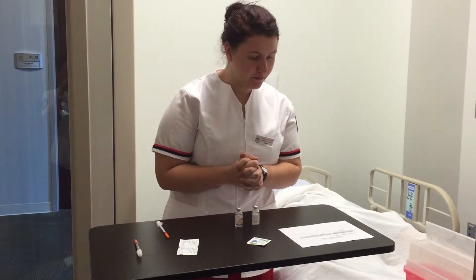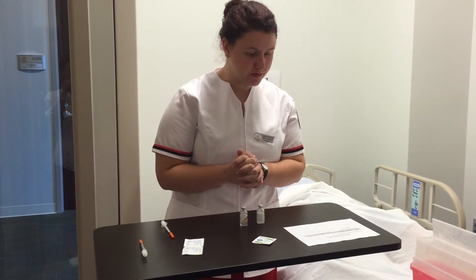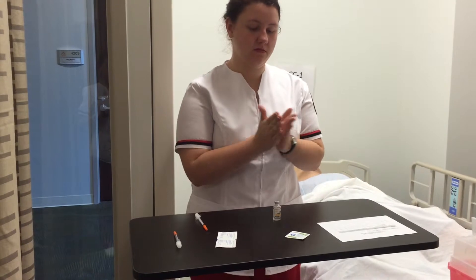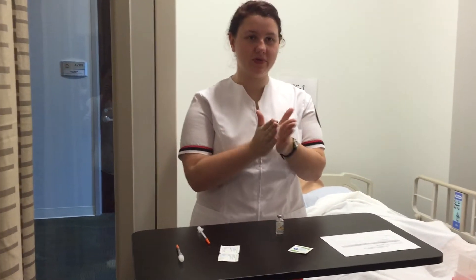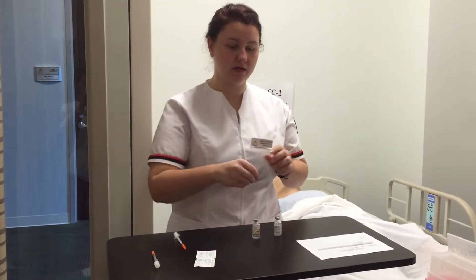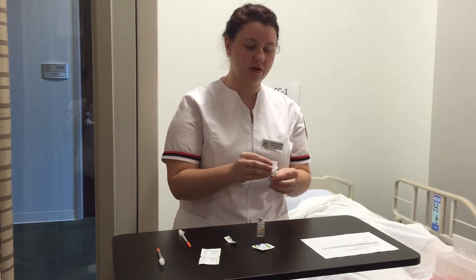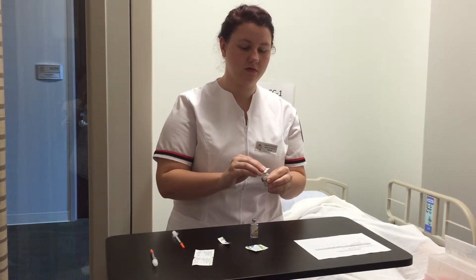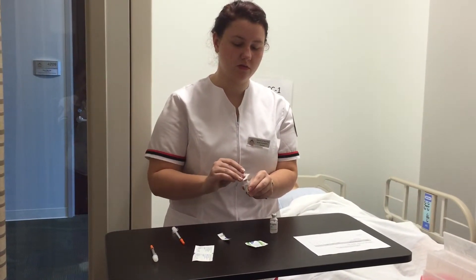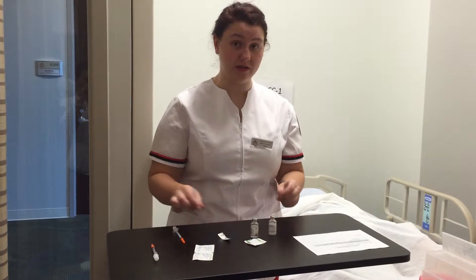Now I am going to roll my insulins — I'm going to roll my NPH just to mix it up. I'm going to take an alcohol prep pad and clean my NPH top. Now I'm going to clean my regular insulin top and I'm placing my vials on a flat surface.